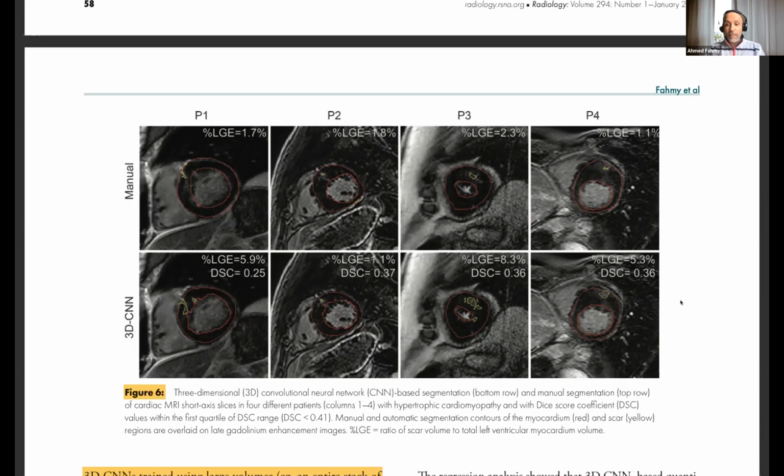So I think, and actually we're proposing something like this in our next study, to have a global model that has some way of internally differentiating between the diseases, and then have a different processing pathway for each type of disease. So we can share common information between the different diseases, like the cross-section of the heart and the body, but then be specific to the scar pattern in some internal processing pathway inside the algorithm.